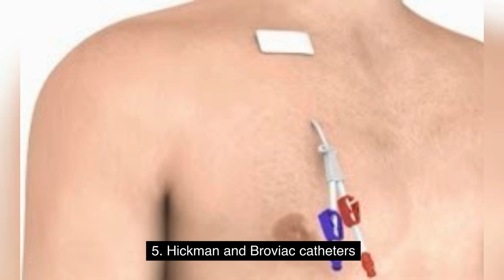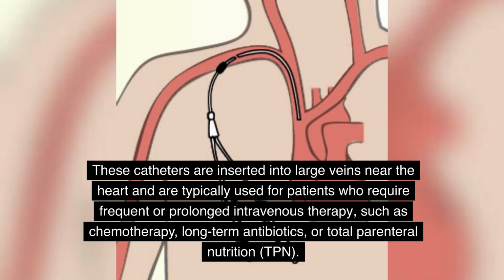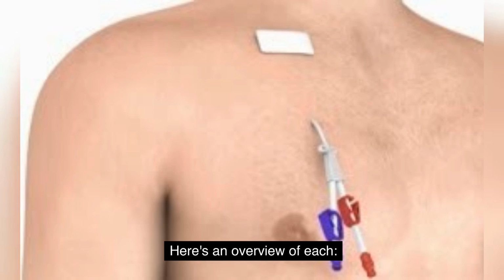5. Hickman and Broviac catheters. Hickman and Broviac catheters are types of central venous catheters, CVCs, used for long-term intravenous access. These catheters are inserted into large veins near the heart and are typically used for patients who require frequent or prolonged intravenous therapy, such as chemotherapy, long-term antibiotics, or total parenteral nutrition, TPN. Both Hickman and Broviac catheters are designed to provide stable and reliable access to the bloodstream. Here's an overview of each.